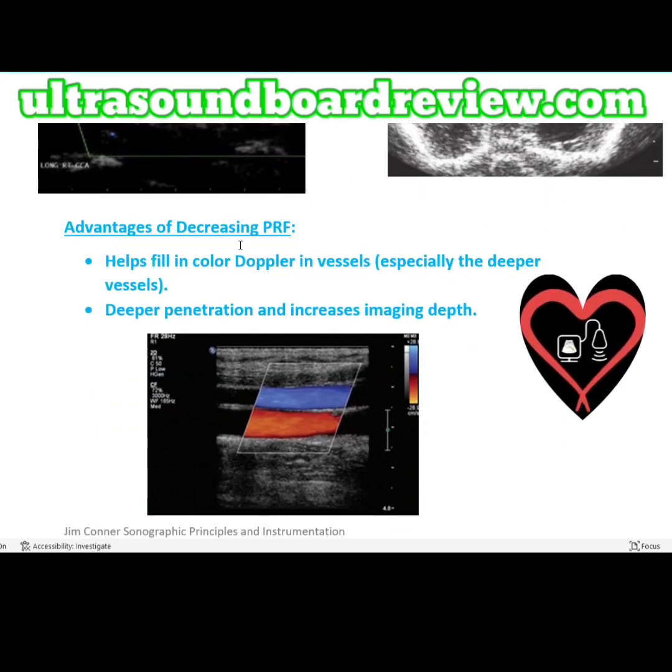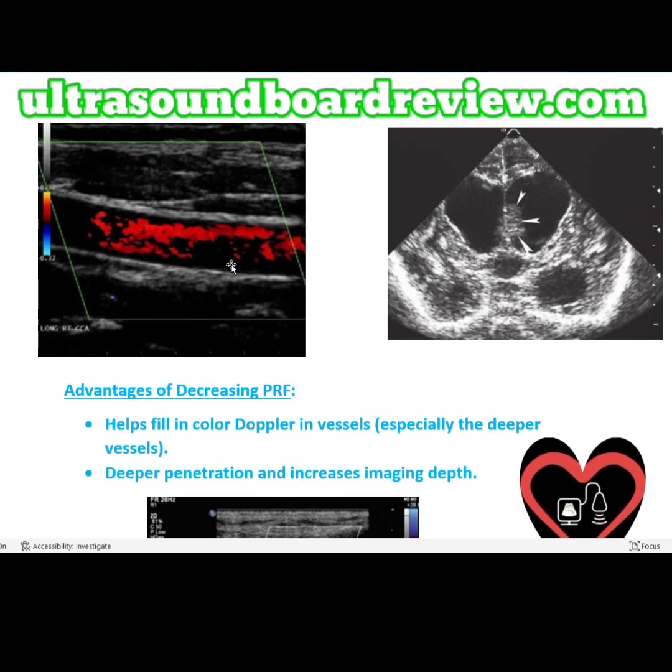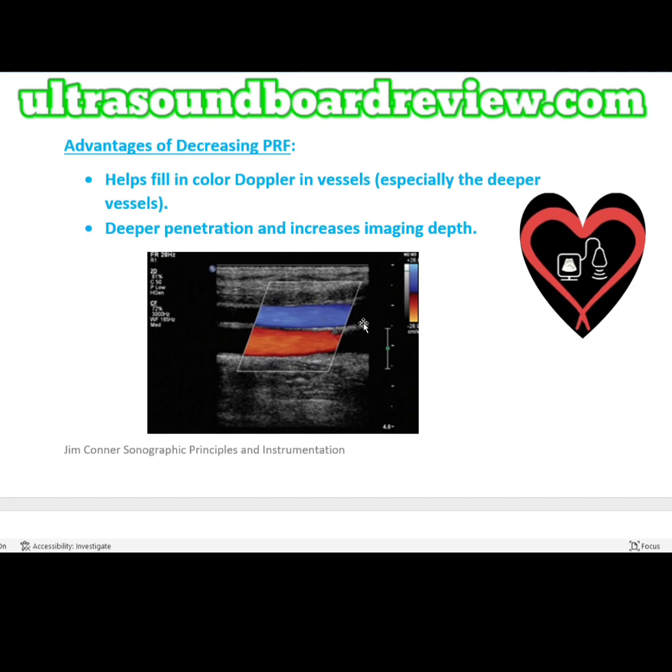The advantages of decreasing PRF include it helps fill in color Doppler in vessels, especially the deeper vessels, and it provides deeper penetration and increases imaging depth. In this image here, you can appreciate that the vessels are completely filled with color as opposed to this vessel. This is because the PRF was decreased.